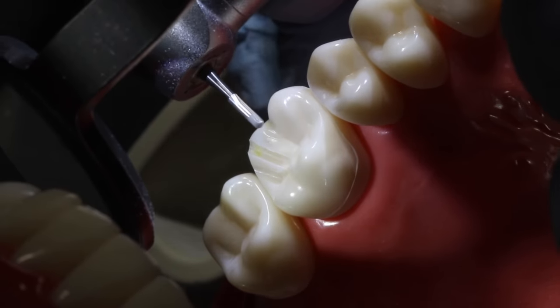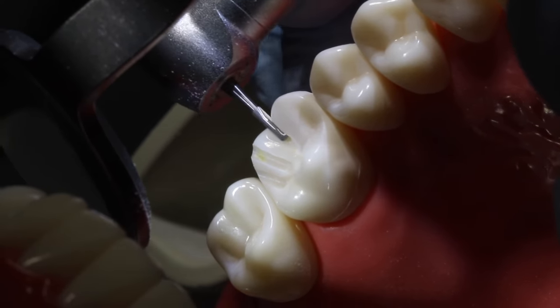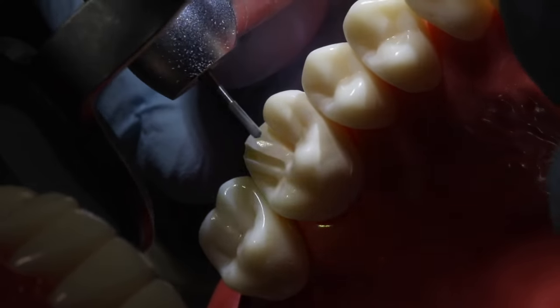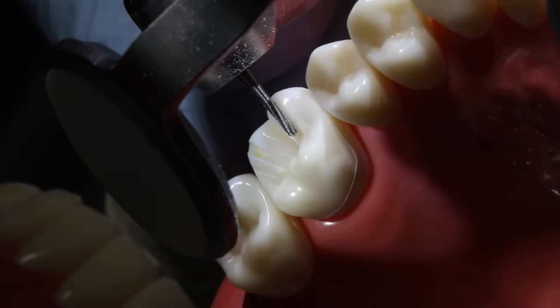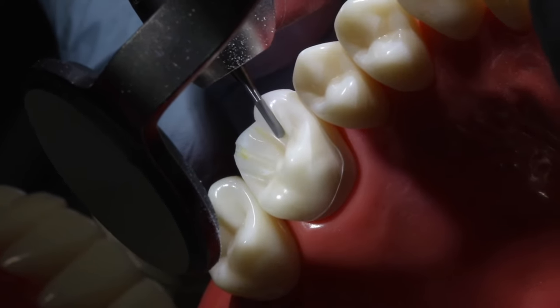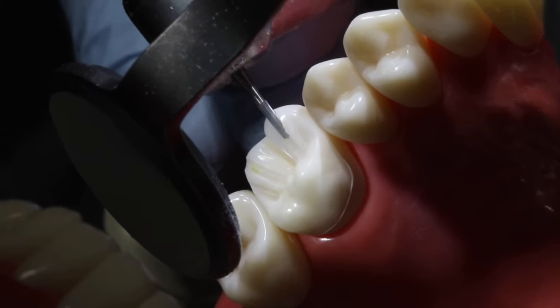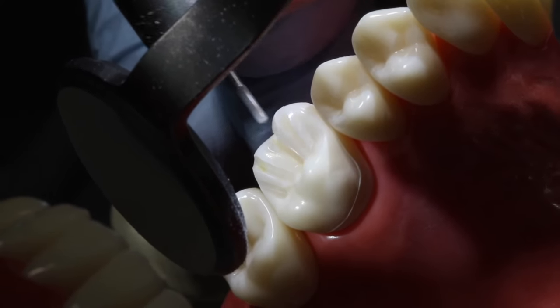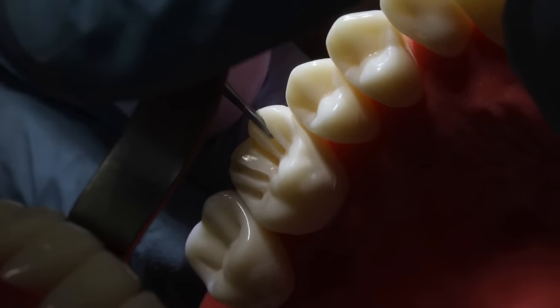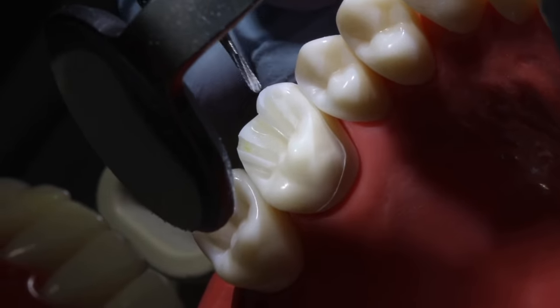So we can put a couple of guide cuts right there. And then now we'll move to the buccal groove. And now the triangular ridge on the mesial buccal cusp. And now we'll go to the marginal ridge area, just mesial to that.